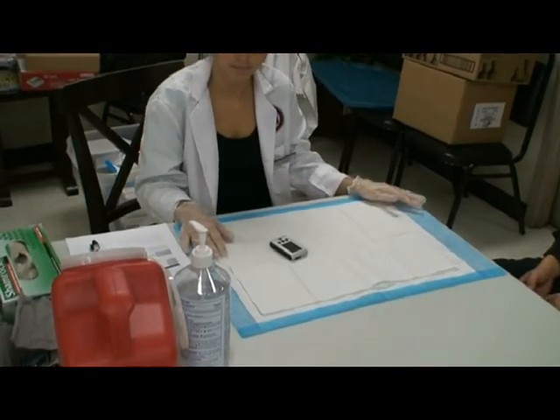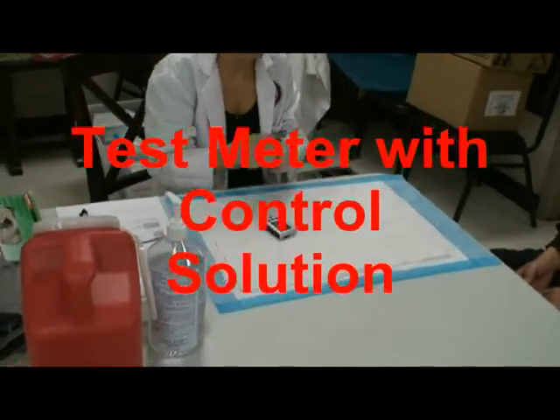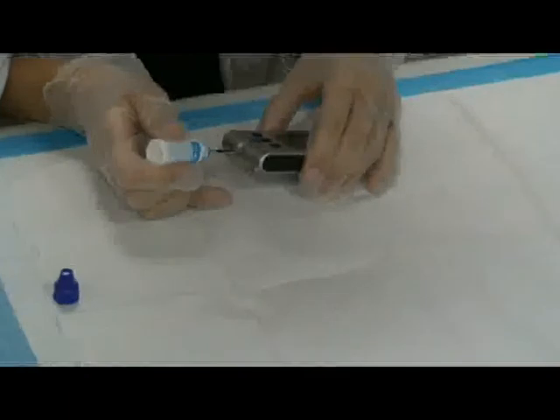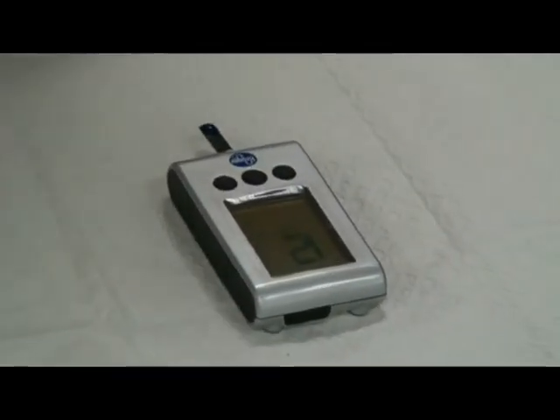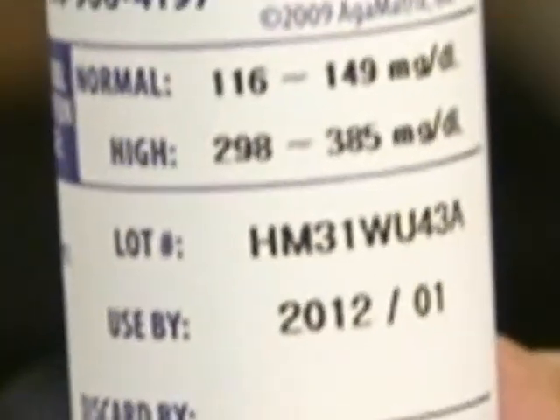Okay, this is a video to show you how to prepare for a wellness screening. The first step is to test the meter by using a control solution. And that is the test solution we're putting on the test strip. It should give us a reading. 121. 121, which is on the test strip bottle, should read 116 to 149, and that is normal.